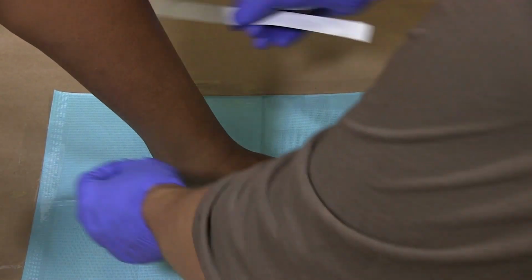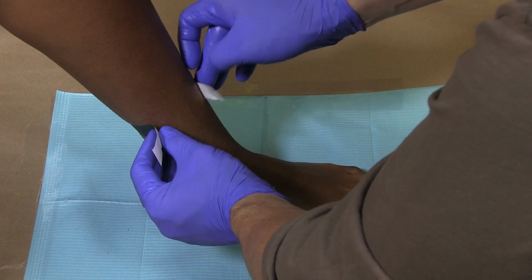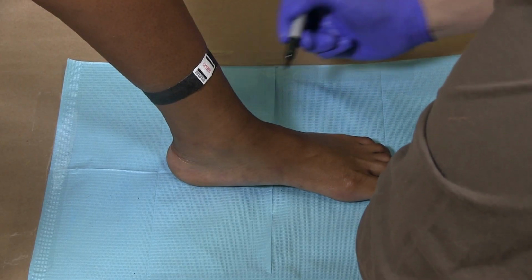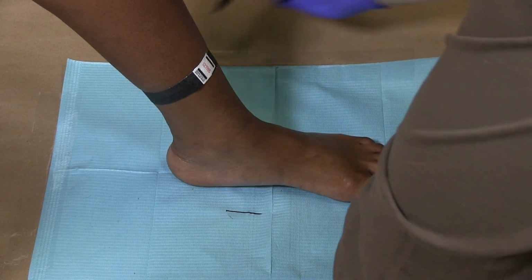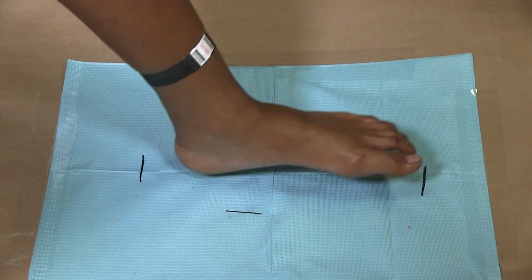Tape the guide ankle band approximately 4 inches above the customer's ankle. This is a marker for how much coverage needs to be achieved with the impression material. Place the customer's foot in the center of the mat and make a rough outline. This will serve as a guide for the placement of the impression material.